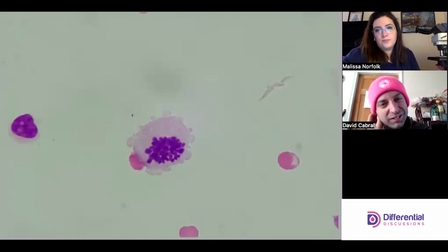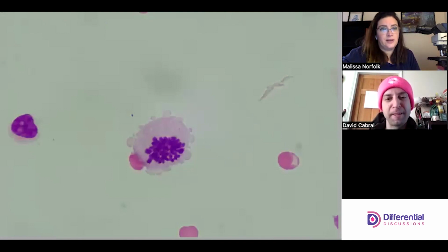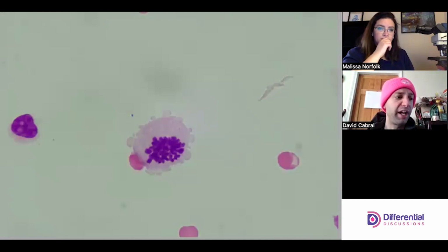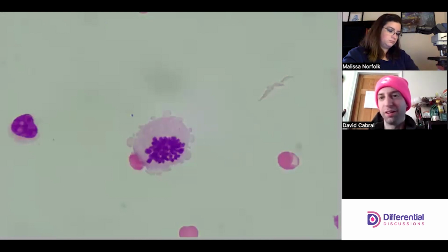Sure, yeah. Noting that there's also a mitotic cell would be helpful for the physician, the pathologist, when they look at it. Melissa and I are pretty darn good at these things, but there's still a lot of uncertainty, and don't ever let pride get in the way of getting a review on things like this.